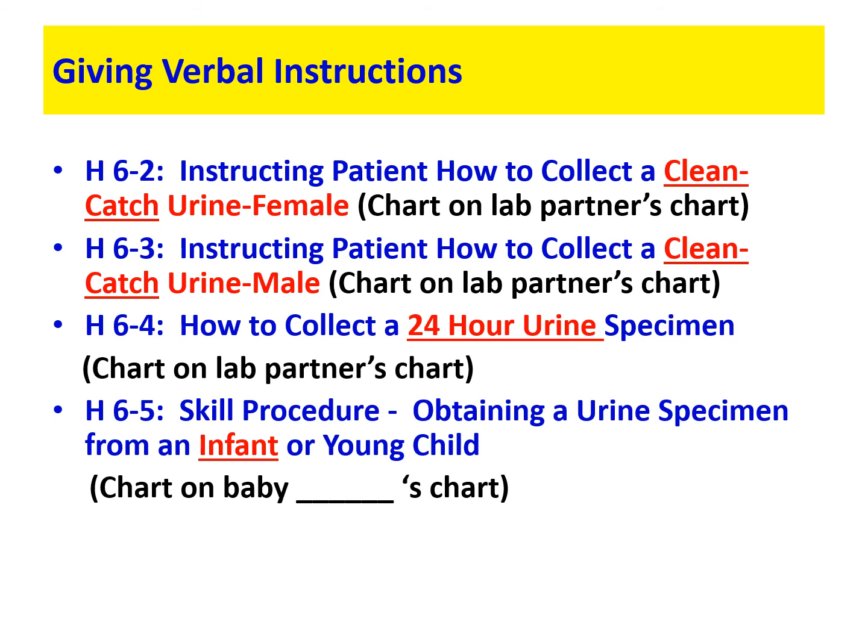Make sure you go from 6 all the way down to putting away any equipment that you're using in your lab and making sure that you take off your gloves and wash your hands, okay? So make sure y'all click off all the boxes on 76 and make sure you read and understand that, as you will be quizzed on how to give instructions on clean catch urines.